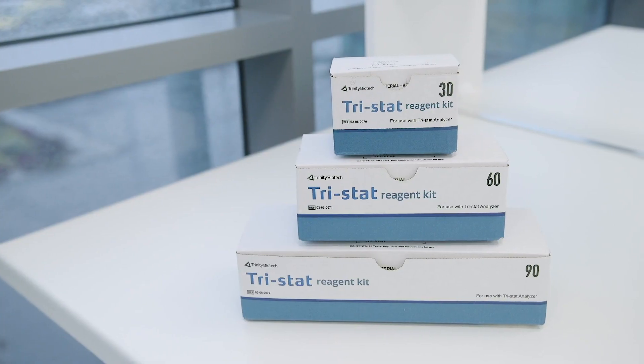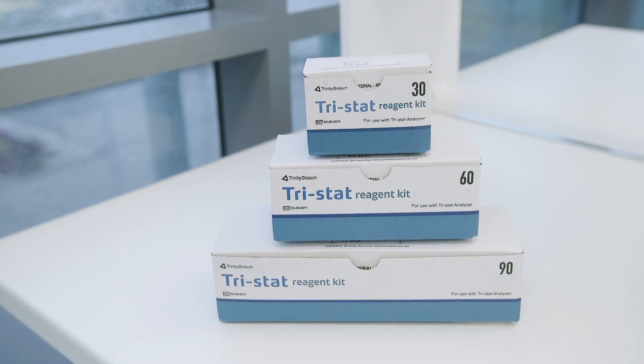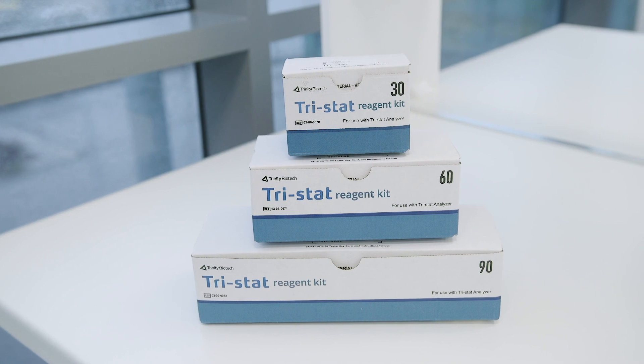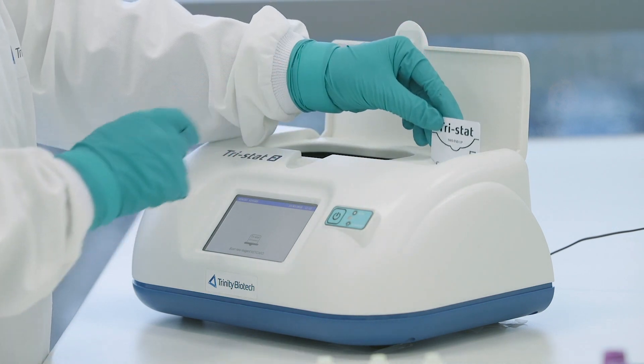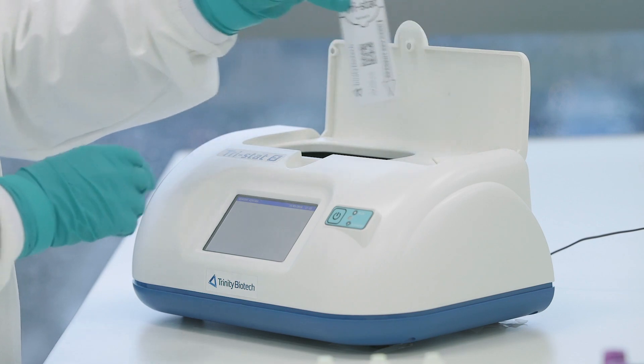Before you begin, please ensure that the reagent tubes have been taken out of the refrigerator and are allowed to come to room temperature before the start of the test. Before a new reagent lot is used for the first time, the enclosed keycard must be scanned to transfer expiry date, lot number, and calibration information to the analyzer.